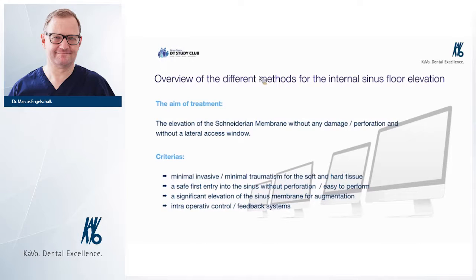We need the bone to give us a primary stability to the implant in this area. With a bone augmentation in the sinus floor, there won't be a healing. So the implant is fixed and tight, and then the augmentation will heal together with the implant. Otherwise, you will lose them all. So I would say 5 millimeters. Well, there's a second reason why we need 5 millimeters, but I will tell you later.